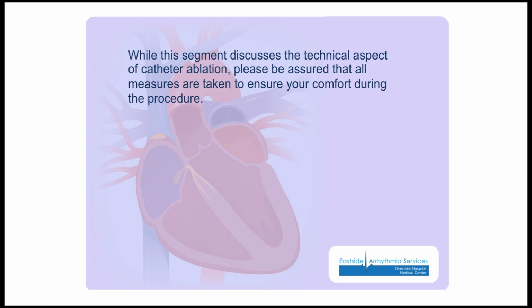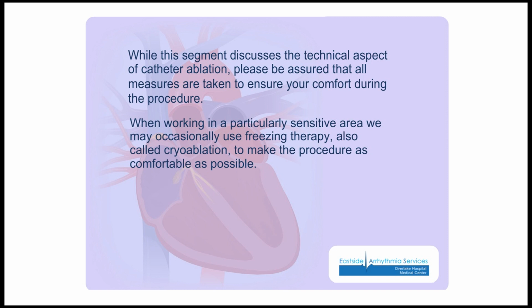While this segment discusses the technical aspect of catheter ablation, please be assured that all measures are taken to ensure your comfort during the procedure. When working in a particularly sensitive area, your doctor may occasionally use freezing therapy, also called cryoablation, to make the procedure as comfortable as possible.